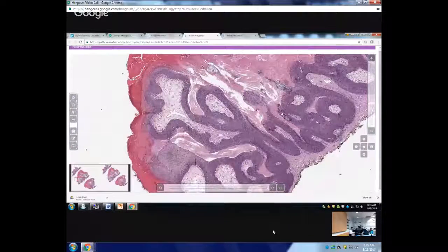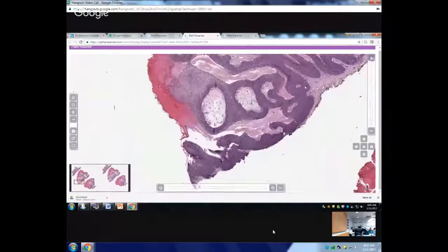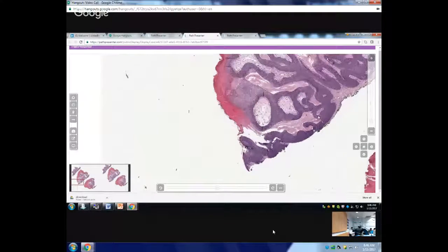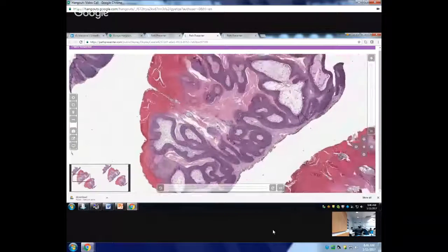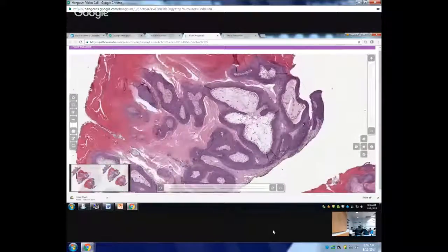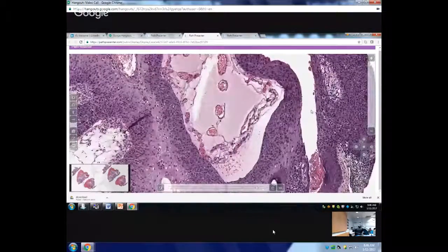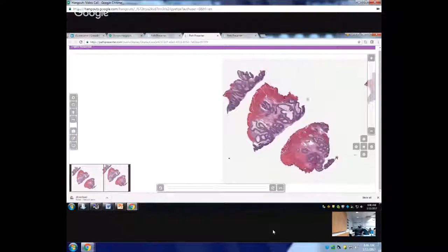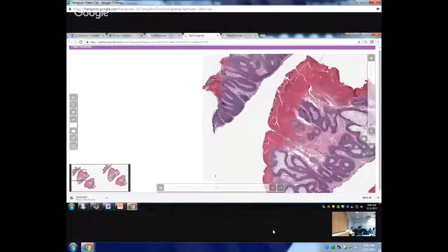So what is your main differential diagnosis? BCC again. Or squamous cell carcinoma, because of the epidermal growth pattern. So how do you make sure this is not squamous cell carcinoma? Normally in this biopsy you don't see it, but if this patient had multiple biopsies, when you move out of the lesion, you're going to see very normal looking epidermis.